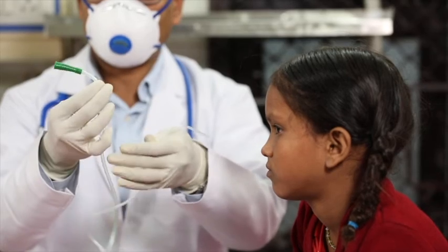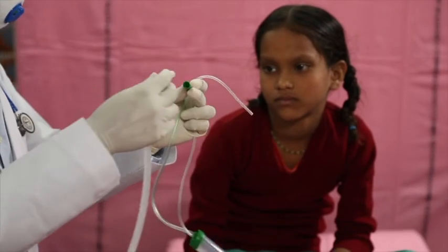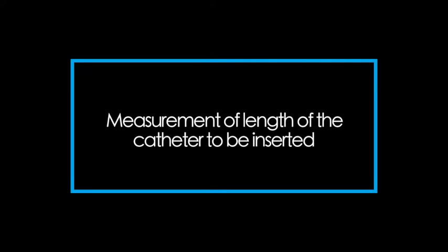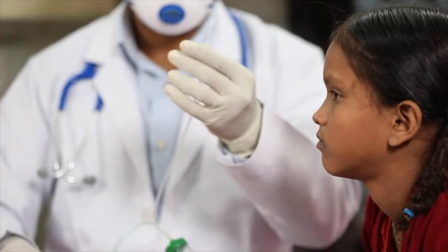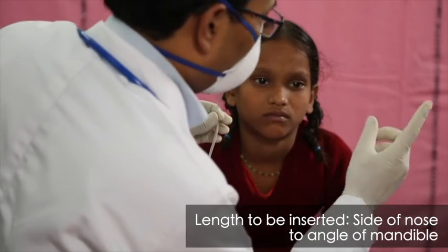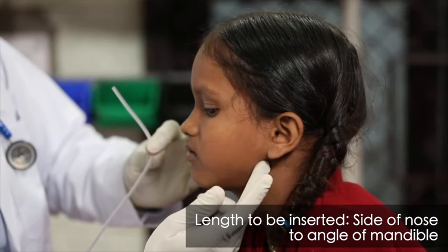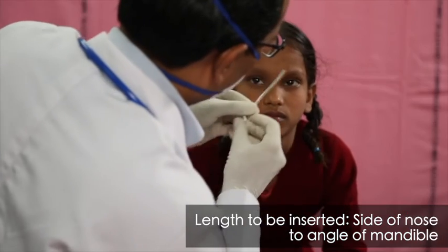The catheter is inserted through the nose. The length of the tube to be inserted is measured from the side of the nose to the angle of the mandible.